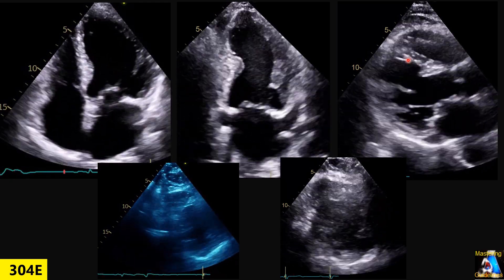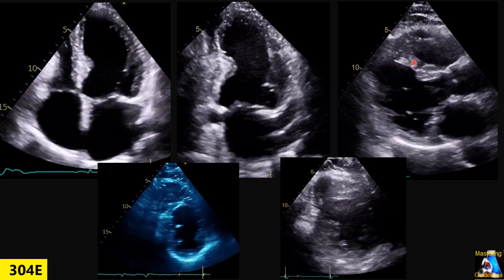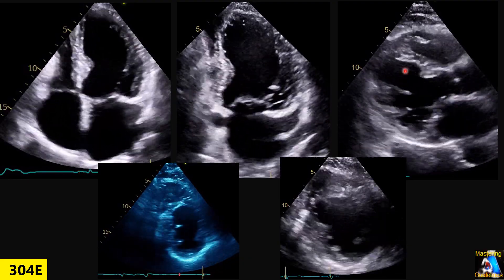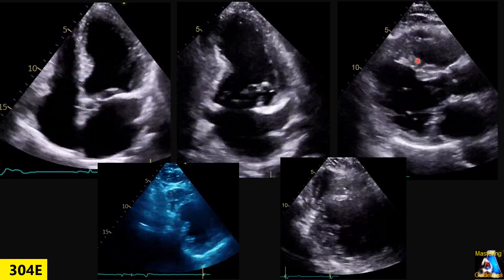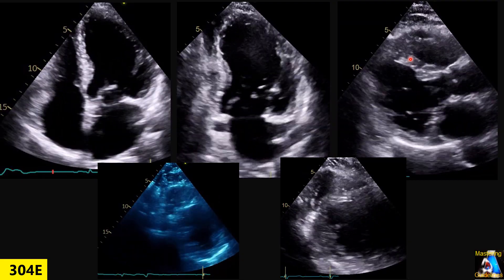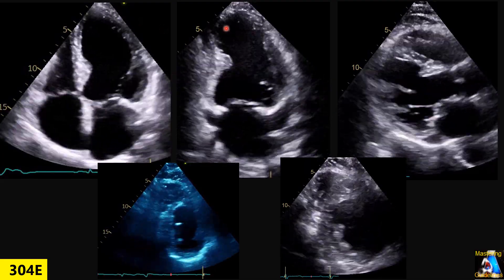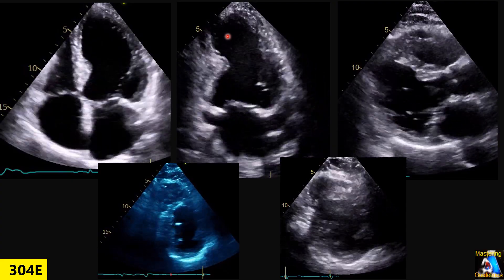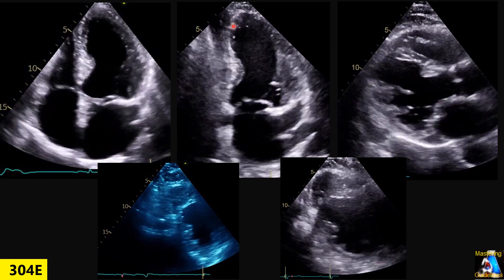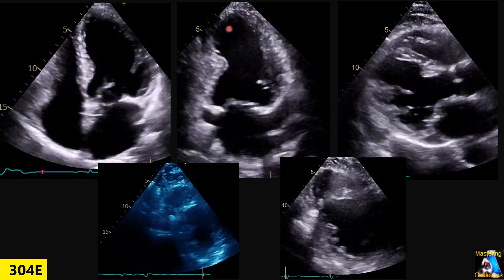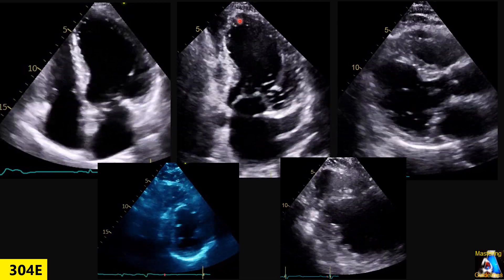As you can see here, even hypokinetic here — we have hypokinetic at the sigmoid — but here we have a little thickening. If you go frame by frame, you can see there is still some contraction, but not too much, so we have hypokinetic here. But at the apex, especially at the apical 2 — inferior wall, apex, inferoapical segment, and apical inferior — the apex is very hypokinetic, and sometimes you can say this is completely akinetic.